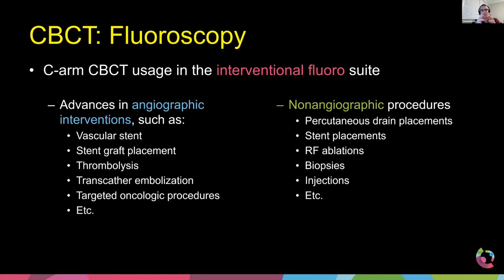But if you're doing a lot of CBCT routinely, then you need to consider that the overall air kerma value for the procedure is going to be skewed higher. So when the hospital sends the overall cumulative air kerma for, say, a biopsy, you're going to write that down. That becomes your DRL. But you may also ask a follow-up question: do you do CBCT, and what would be the typical CBCT dose for those biopsies? It might be whatever percentage of that, and then you would list that as separate. You don't necessarily need to take the CBCT dose out of the interventional procedure because it's part of the procedure. But you could list it separately so that people know the rough dose levels you should still be aiming for when you do a biopsy that includes a CBCT.